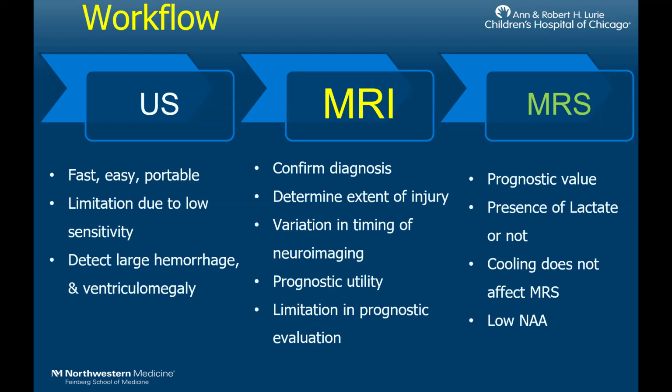If it's too early, i.e., within that first day of life 0 or 1, it can be falsely negative. Why? Because it's too early, and the changes have not occurred. So it's kind of good to check when that MRI was done.